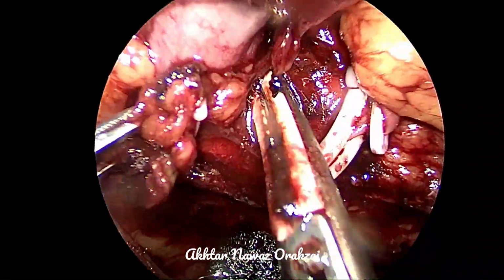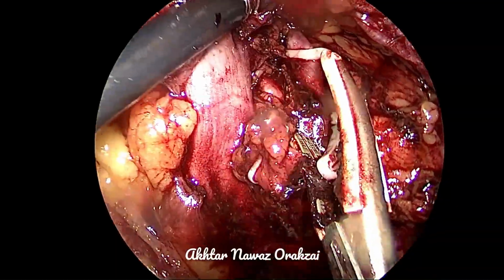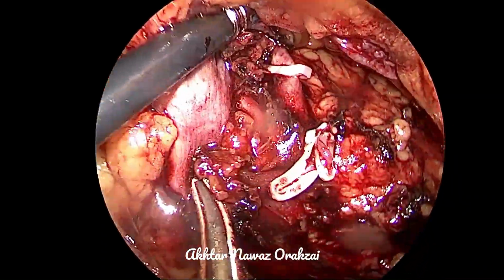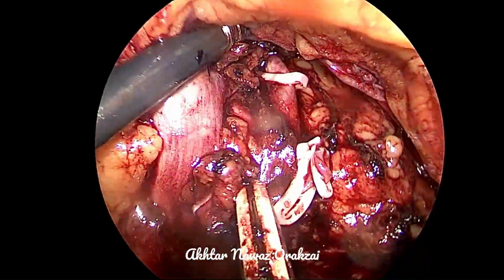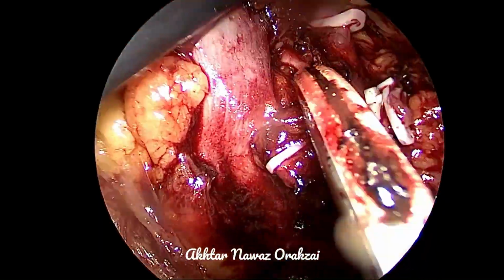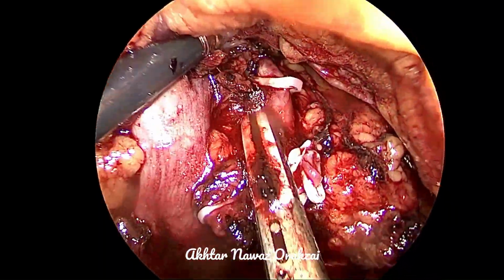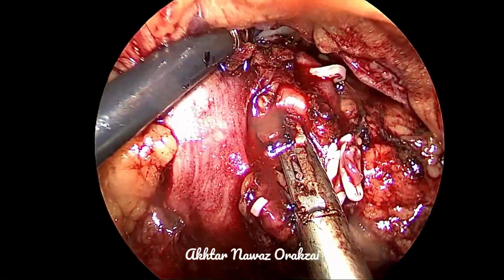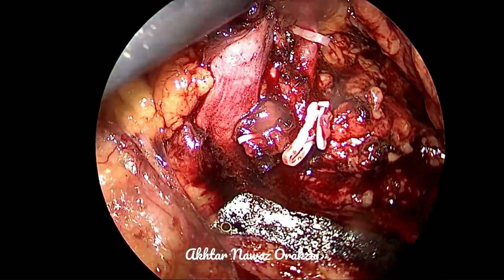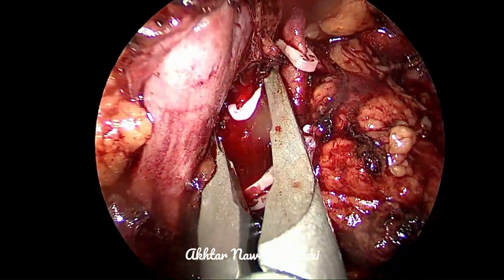This is the periaortic lymphatic tissue. It always accompanies the arteries. When I'm unable to find the artery, I always try to look for the lymphatic tissue. So whenever there is a lymphatic tissue, it means that this lymphatic tissue is harboring an artery. So here we see another artery here, but as I said earlier, this is a bifurcation, so the main stump remains lower down.